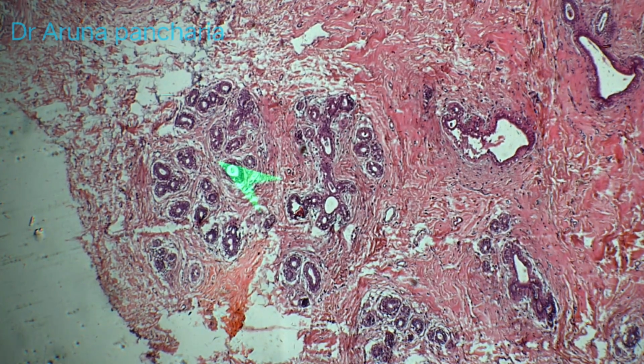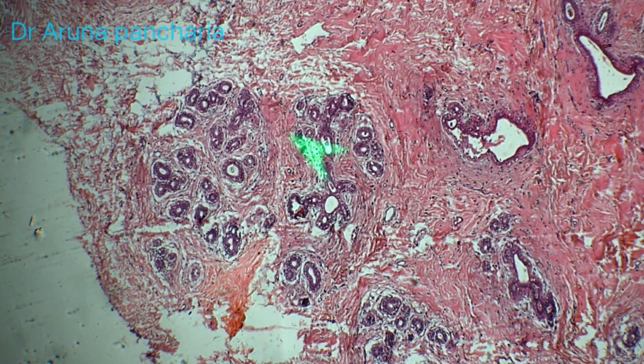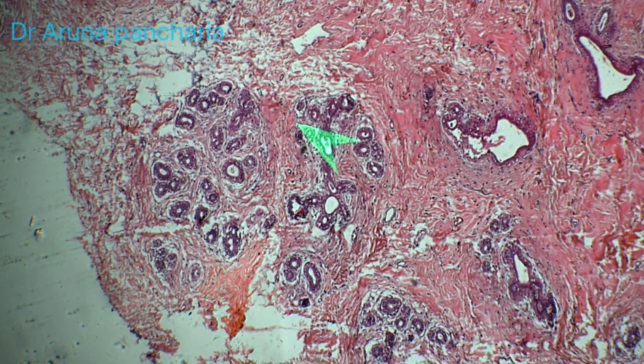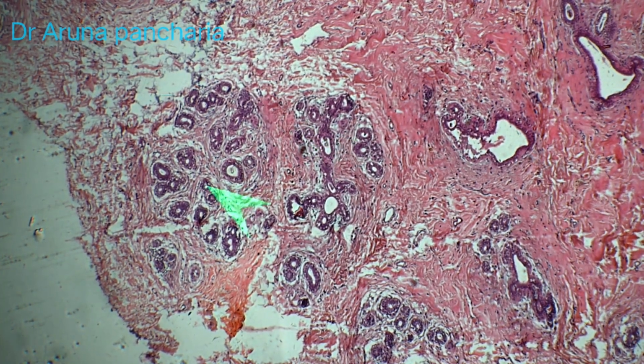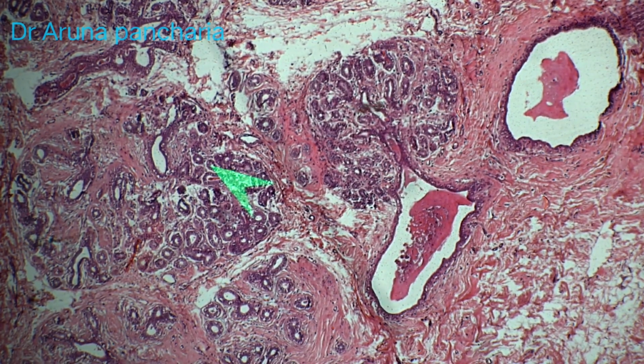Whatever the stroma inside the lobule, as I told you, this is a single lobule, whatever the stroma inside one lobule is called the intralobular stroma. Outside the lobule, whatever the stroma is there, this is called the interlobular stroma, or in between the 2 lobules, this part is the interlobular stroma. The 2 types of stroma are very important because the fibroadenoma arises from the intralobular stroma, the expansion of the intralobular stroma.